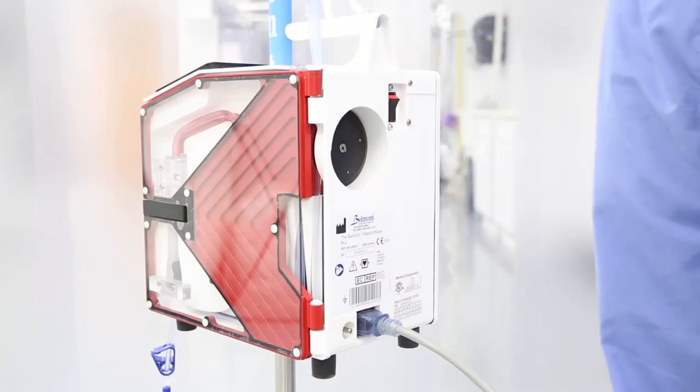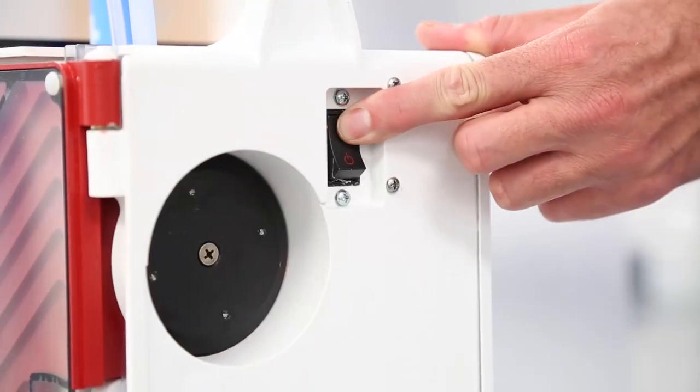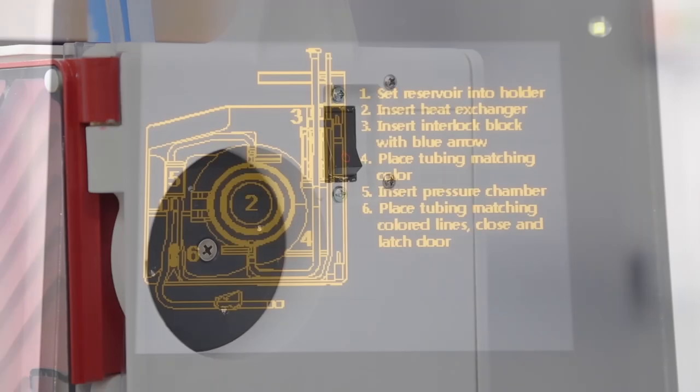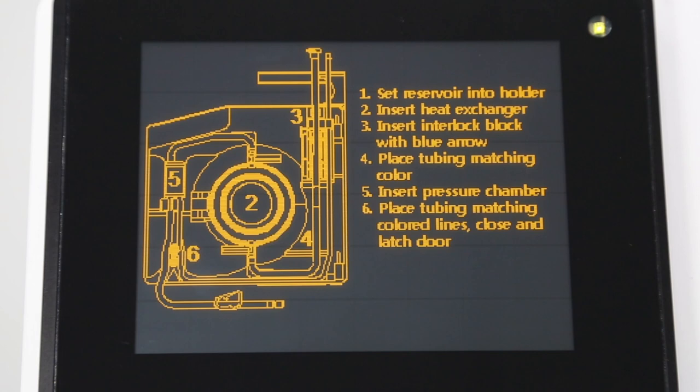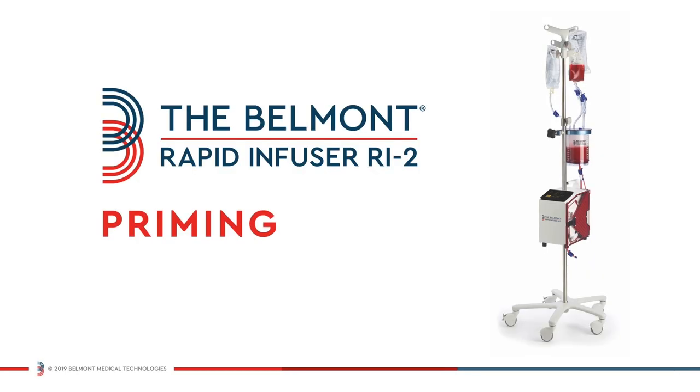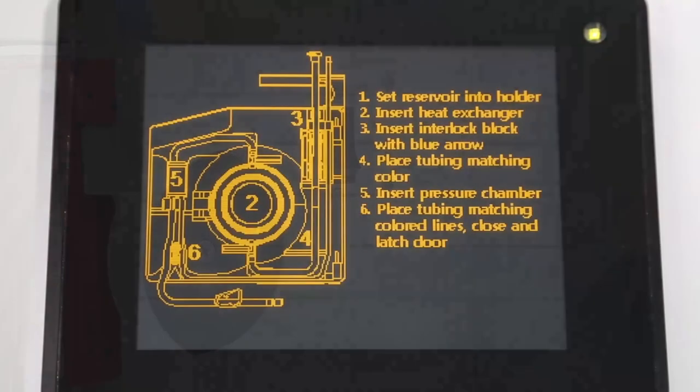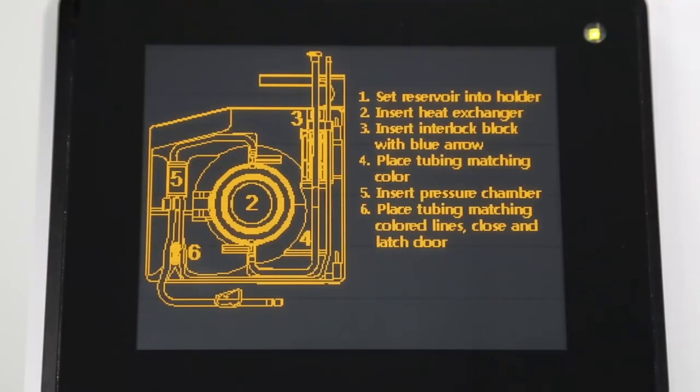You are ready to power on the system. Press the power button firmly to the on position which is located on the back of the device. After a brief self-test, operation instructions will be displayed on the screen. When first switched on, the screen will display instructions for installing the disposable set.